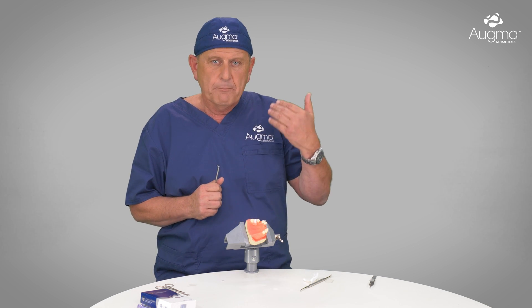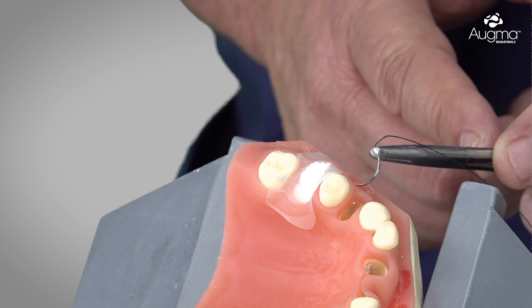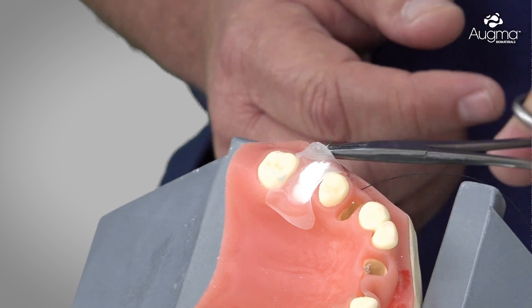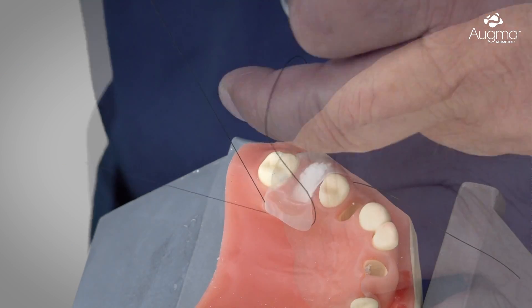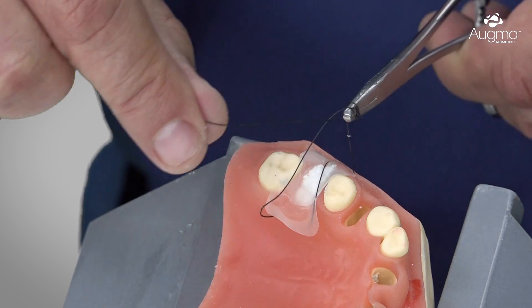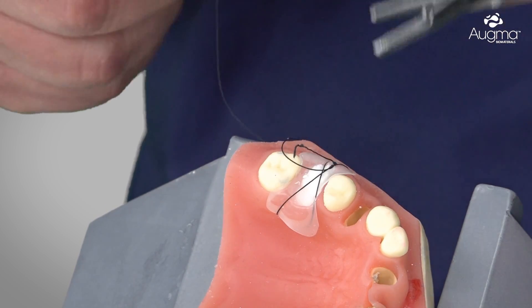The technique is quite simple. Below the OGMA Shield, we introduce the needle from the mesial aspect to the distal, then go to the palatal aspect from the mesial to the distal and make our knot on top of the OGMA Shield. Going from the mesial aspect to the distal, below the OGMA Shield, then crossing to the palatal aspect from mesial to distal and making the knot on top of the OGMA Shield. If we feel we want to make another cross suture, of course it's possible. If we are not sure it's stable enough, we add another cross suture.